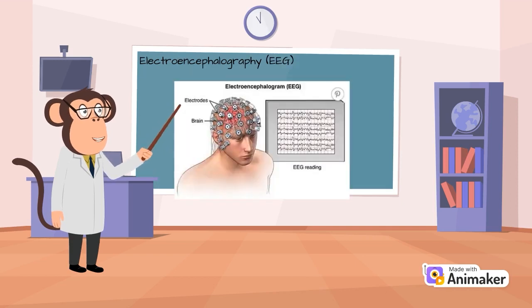Electroencephalography is a technique for recording and interpreting the electrical activity of the brain. To record the electrical activity of the brain, electrodes are attached to the scalp. Each pair of electrodes transmits a signal to one of several recording channels of the electroencephalograph. This signal consists of the difference in the voltage between the pair. The rhythmic fluctuation of this potential difference is shown as peaks and troughs on a line graphed by the recording channel.